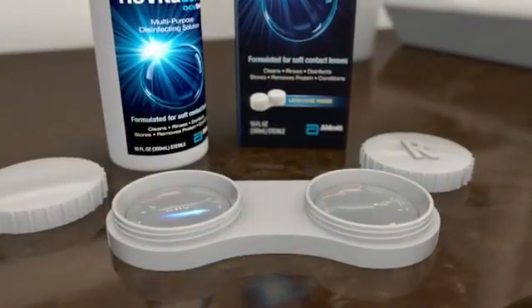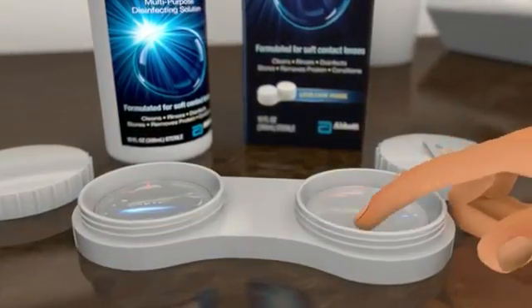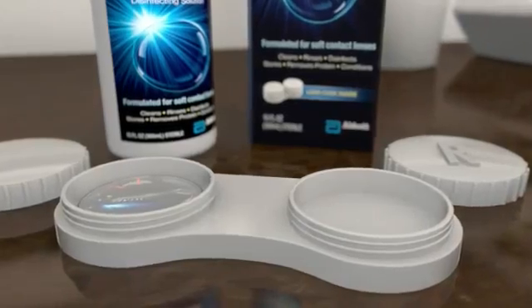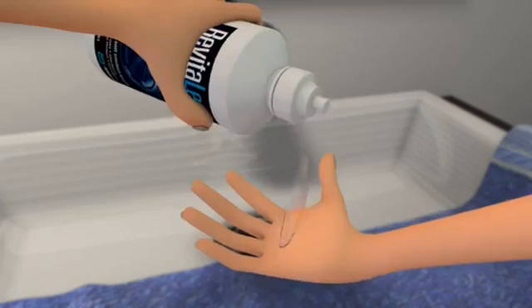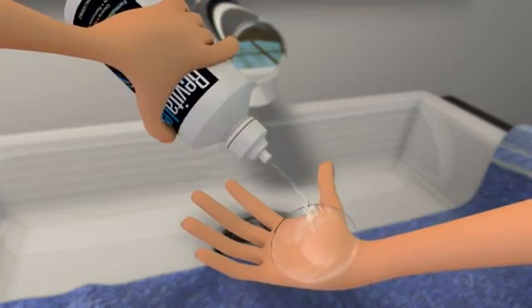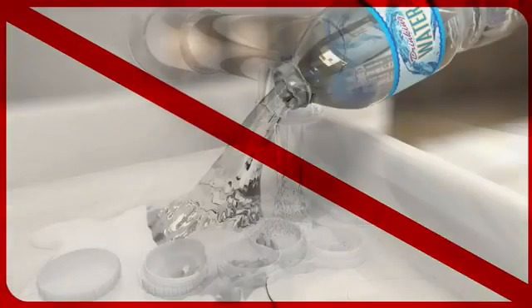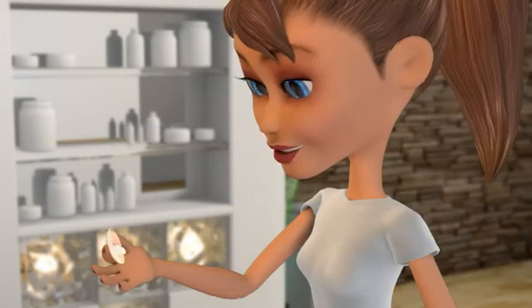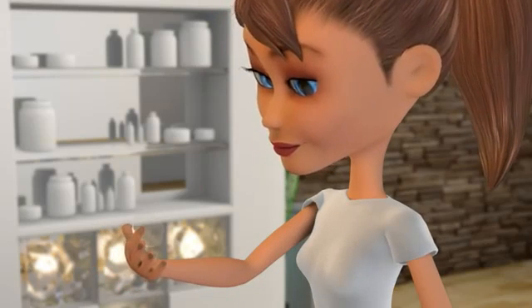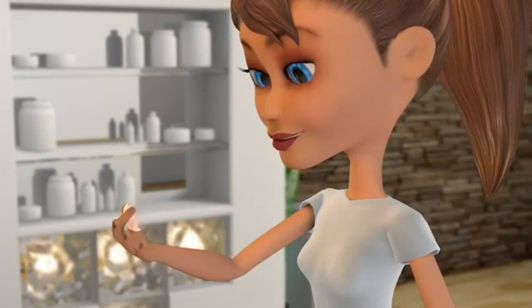Next, remove one lens from the lens case or new contact lens package. Here, I'm removing the right lens first. Rinse each side of the lens for 5 seconds using fresh contact lens solution to remove any debris from the surface. Never, at any time, use tap water, bottled water, or saliva on your lenses and lens case as it increases the risk of infection. Next, place the contact lens on the tip of your clean index finger. Make sure your finger is also dry because if it's wet the lens may cling to your finger.